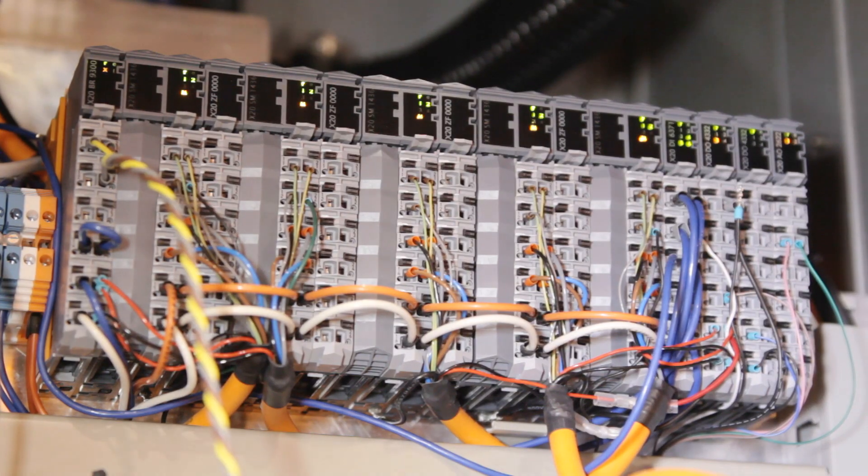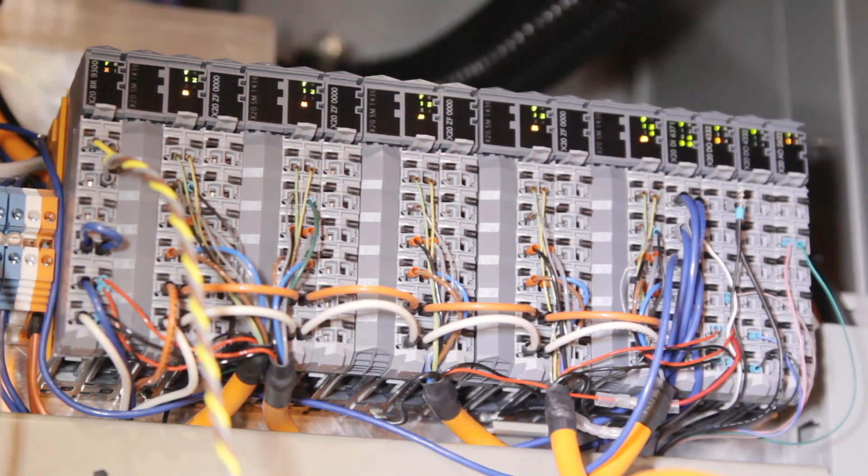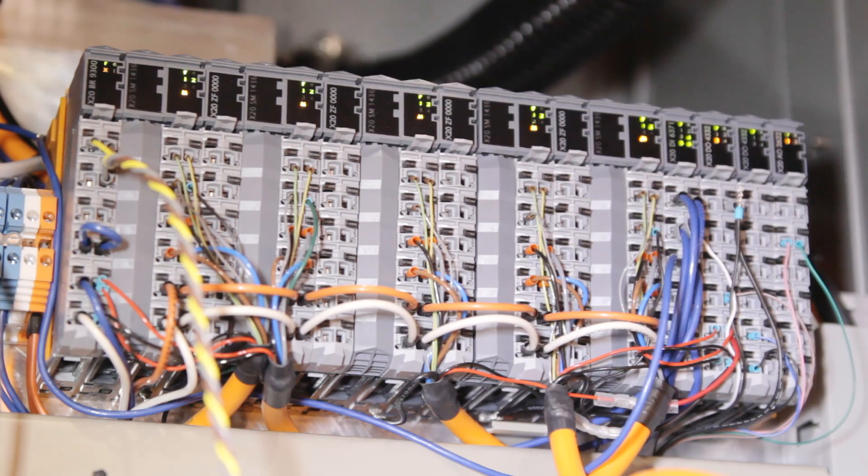The I/O and the drives are in our X20 form factor, which makes for a modular, easy-to-wire, efficient design of the control system. Another advantage of the X20 form factor is if you need to add modules for additional functionality, it's easy to just stack them on the end of the block.